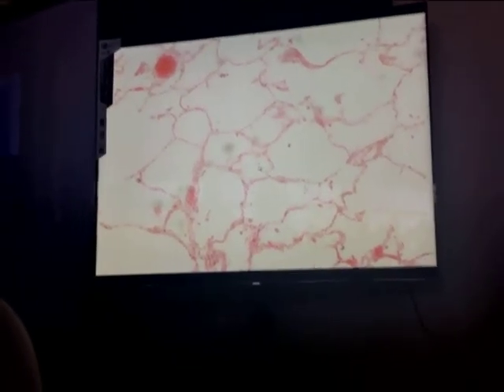Okay, so that you will be able to identify the abnormality of this condition. Pay particular attention to the size of the alveolar space as shown. Okay? That is the regular size of the alveoli.